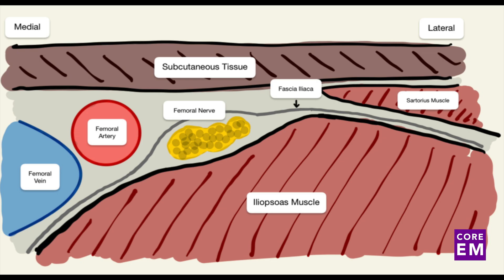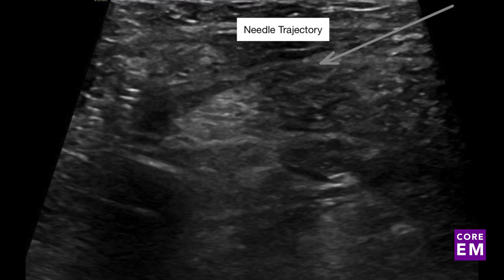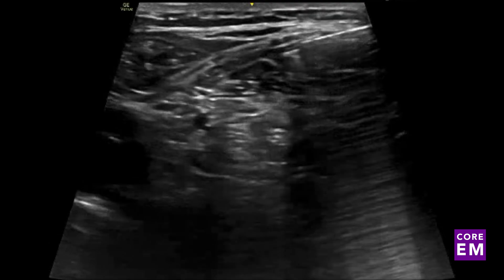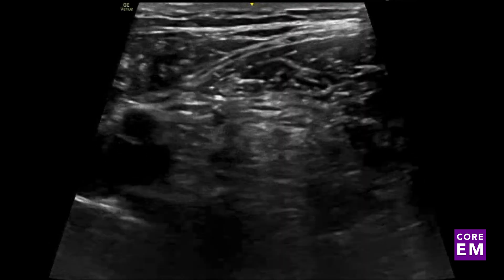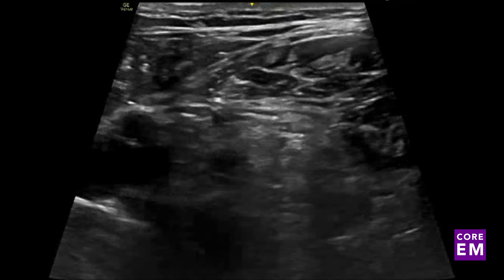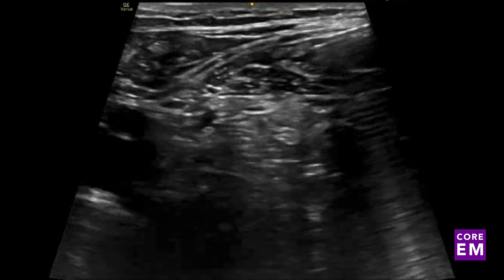The femoral vein is more medial and the femoral artery is lateral. A common mistake is to have the transducer too low — you want to make sure that you're proximal to the femoral artery bifurcation. Just lateral to that, the femoral nerve is going to be visible. It's important to remember that this is a planar block, meaning instead of injecting medication directly adjacent to the nerve bundle or intraneurally, we're going to inject underneath the fascial plane lateral to the nerve, to bathe medication around the femoral nerve, lateral femoral cutaneous nerve, and possibly proximal into the lumbosacral plexus. This way, the needle tip stays further away from dangerous targets and complications, and the medication will naturally flow in the correct location — proximal and medial. The needle is going to be advanced laterally to medially, passing through the sartorius muscle until you see and feel the needle pop through the fascia iliaca overlying the iliacus muscle.